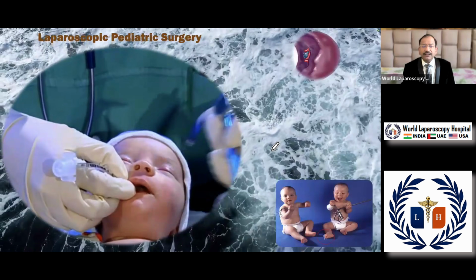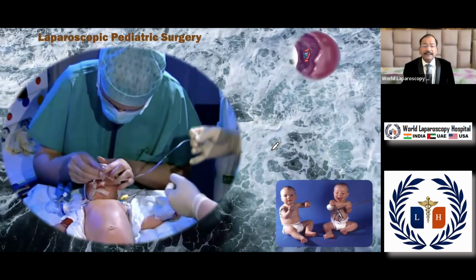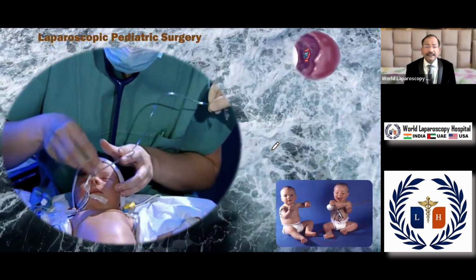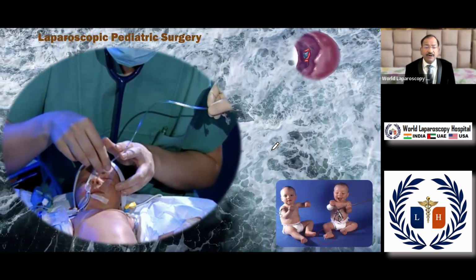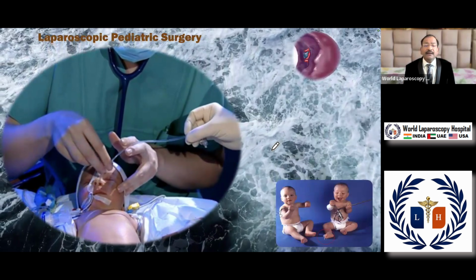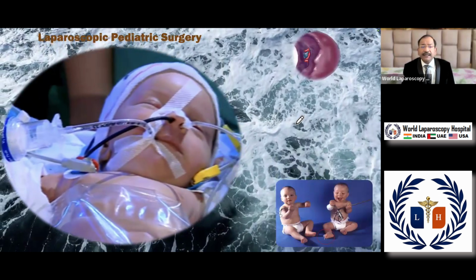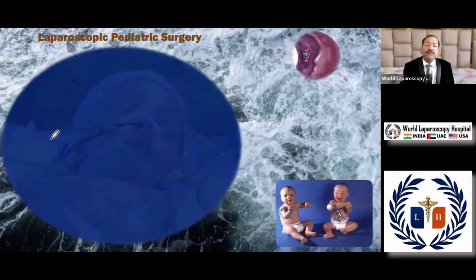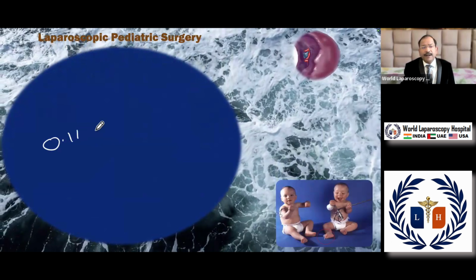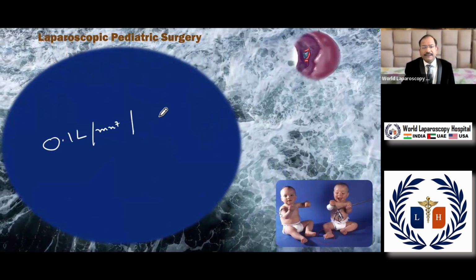After that, another important thing is that we have to do continuous gastric aspiration, so that acid content should not get aspirated into the trachea of the small kid, it means infant. And the rate of flow of CO2 is very important. In the pediatric patient, the rate of flow of CO2 is 0.1 liter per minute per year of age.